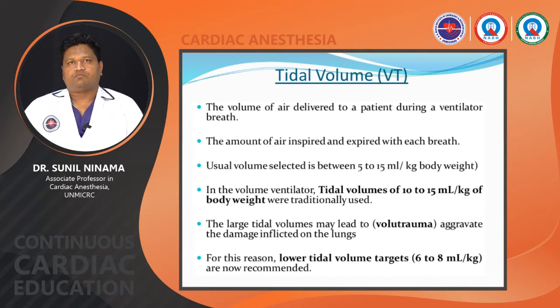What is tidal volume? The volume of air delivered to the patient during a ventilator breath. The amount of air inspired or expired with each breath. Usually the volume selected, that is how much tidal volume you have to keep in that patient, is around 5 to 15 ml per kg of body weight.